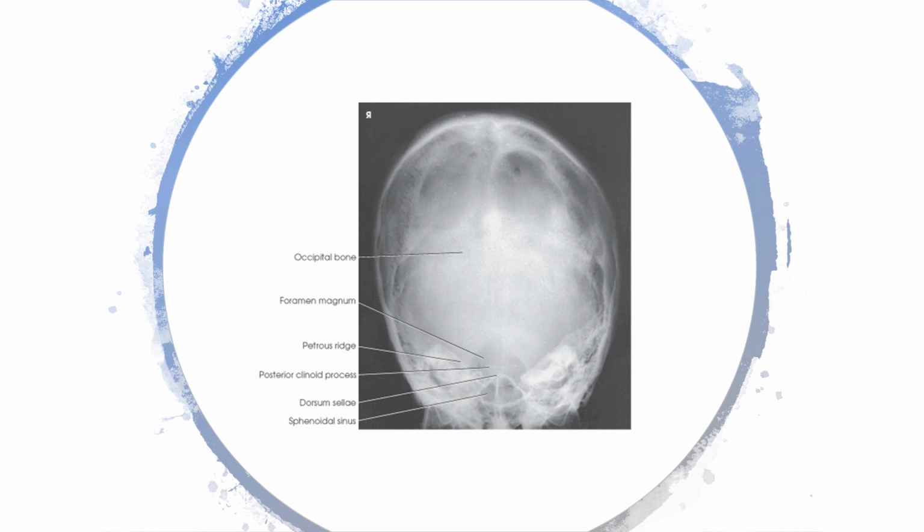They still slope downhill toward the center. And again, the angle is going to be similar. Now it's about 20 to 25 degrees downhill. Because we have less tube angle, they're going to appear a little bit flatter. So more like 20 to 15 degrees downhill for mesocephalic, and then of course plus or minus 5 to 7 degrees for the other two skull types.